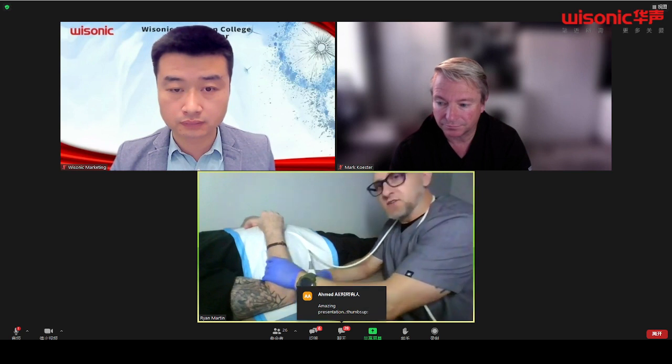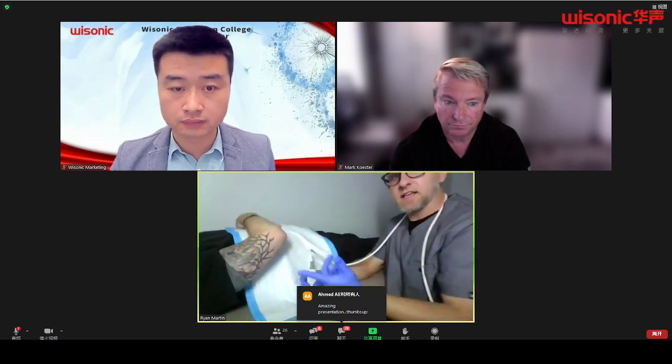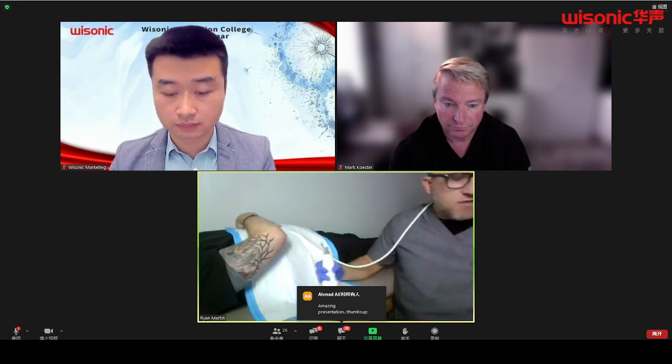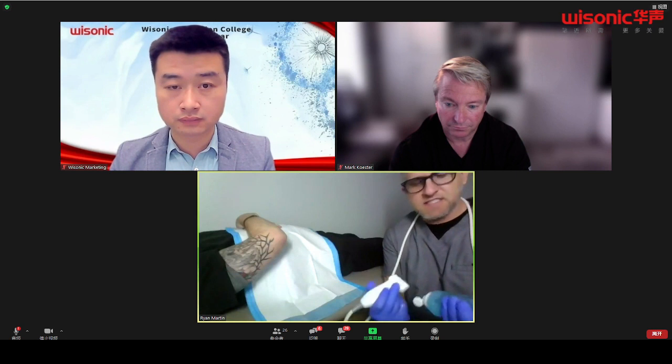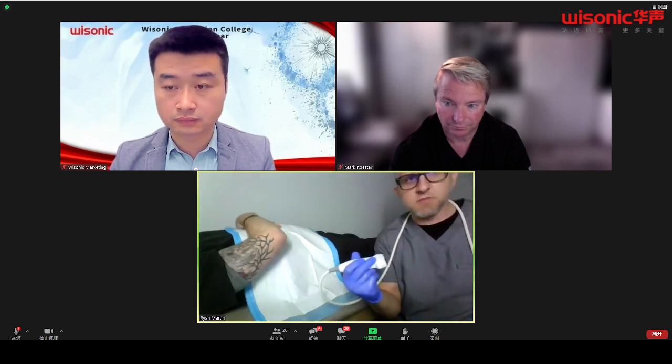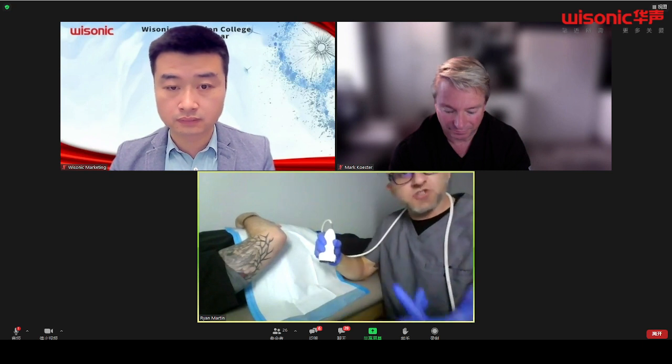So all we have to do is basically just say, can you put your arm right here for me? And look at that. I can see everything I need to right here. So let's start in that long axis view like I did in the presentation. Now I know these are a little mixed up and I didn't go to the medial side yet, but I'm saving that one because I'm going to turn him to the side to show you some of the medial structures.